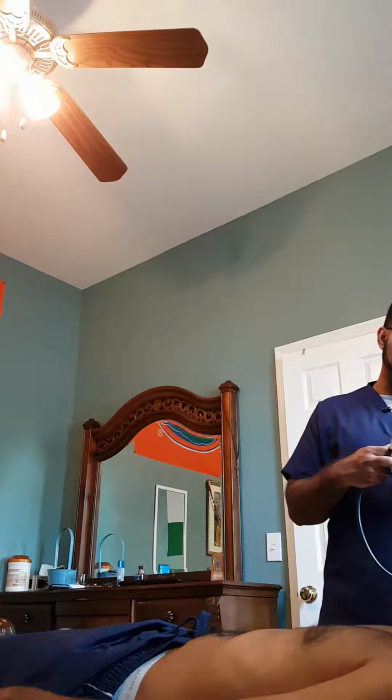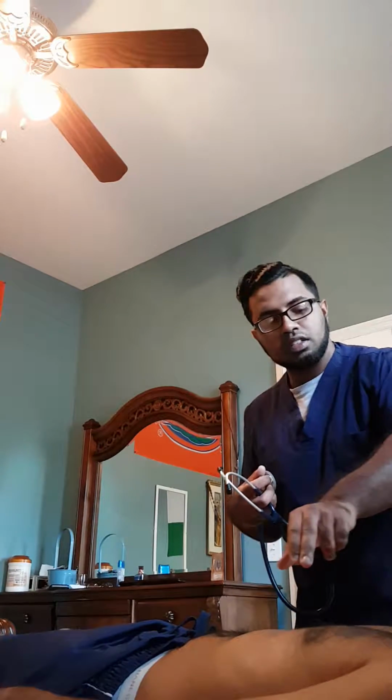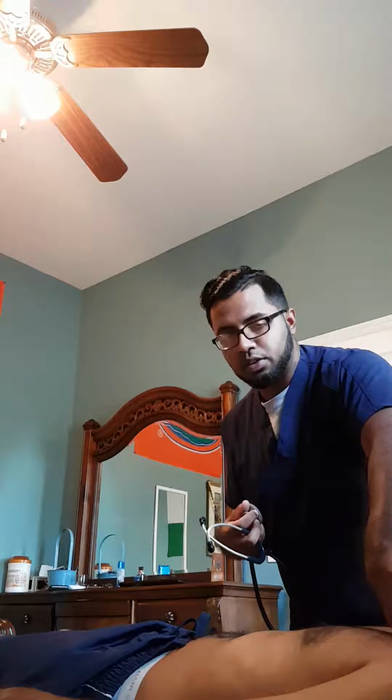Next, I'm going to listen to his heart. One thing I want to note about the stethoscope, this stethoscope has the bell and the diaphragm all incorporated into one side. So what I'm going to do is listen to his carotid artery. I'm going to be feeling for the thrill and listening for the bruit. So let me just palpate him here. I do feel the thrill, and just look straight. I'm using my index and my middle finger. I'm not using my thumbs when I'm palpating here. And I do feel the thrill.